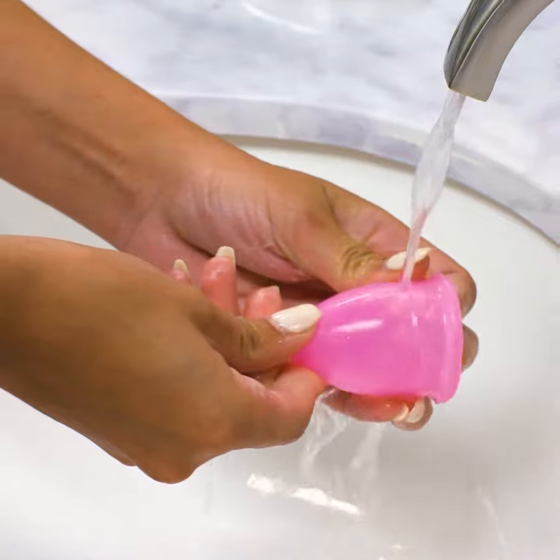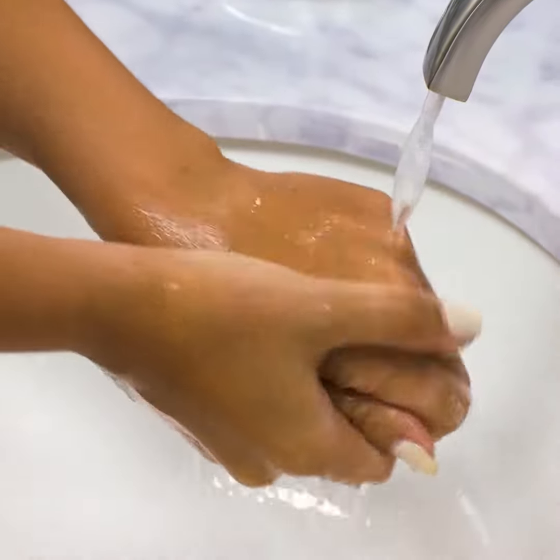Then, gently wash it with a mild soap that's free of perfumes. While you're at it, don't forget to wash your hands too.